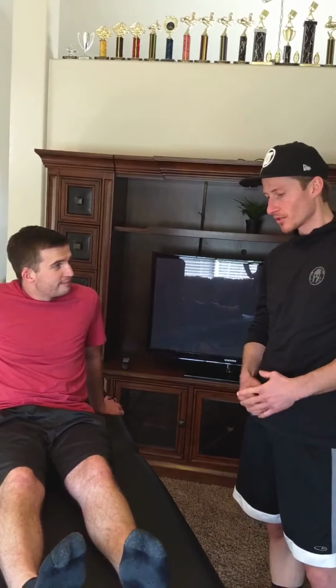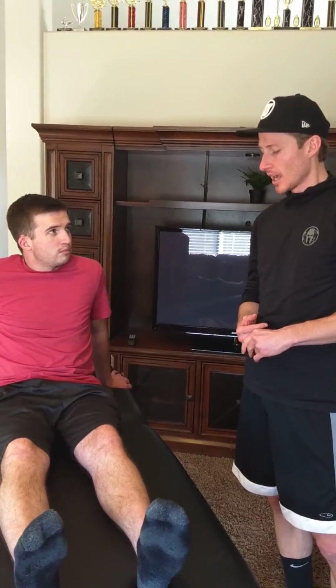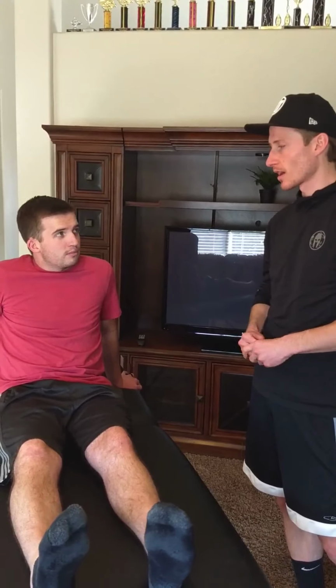So first of all, we're going to Hank. Nice job with your session today. And just at the end here, what I want to be doing is we're going to be applying what we call Estim. Okay, and the purpose behind this is we want to alleviate some of the pain that you're feeling with your knee, with your osteoarthritis.